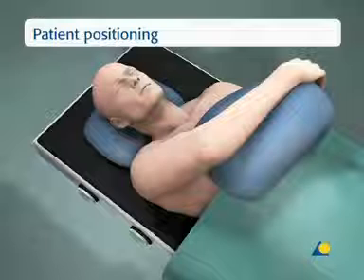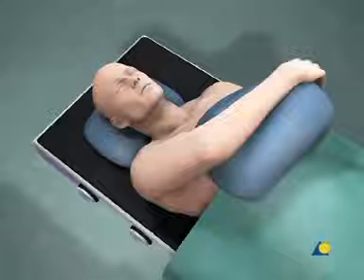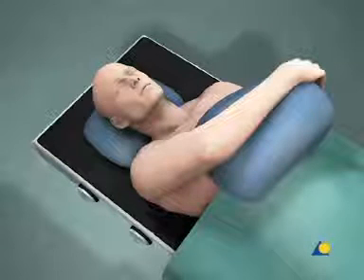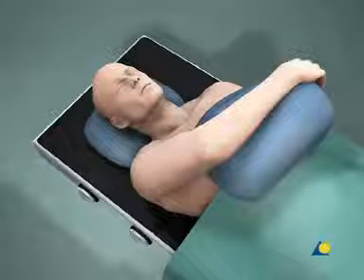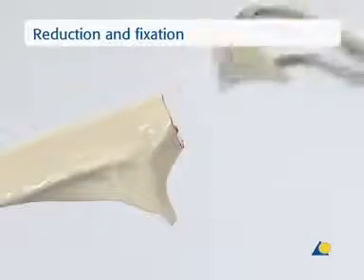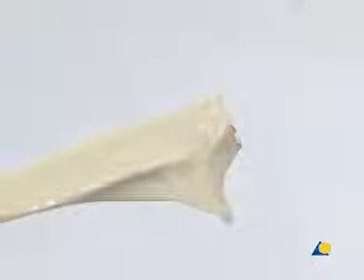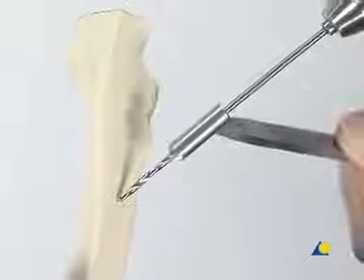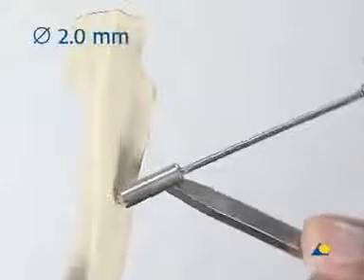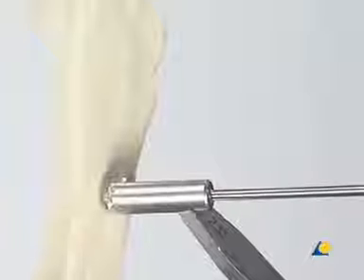The patient is positioned supine on the radiolucent table. The extremity is prepared from the axilla to the hand, allowing rotation of the forearm as well as flexion and extension of the elbow during operative fixation. The bone model has a transverse fracture of the olecranon. Approximately 4 centimeters distal to the fracture line, a hole is drilled transversely through the ulna with the 2-millimeter drill bit using a drill guide, positioned roughly in the center of the bone.